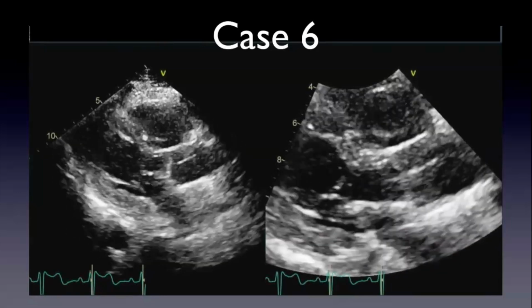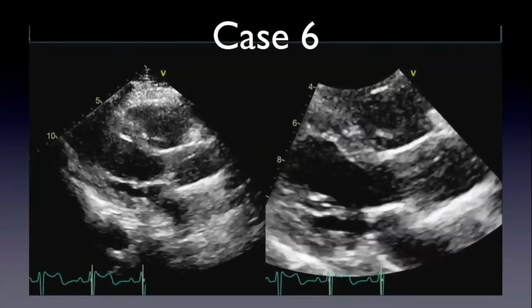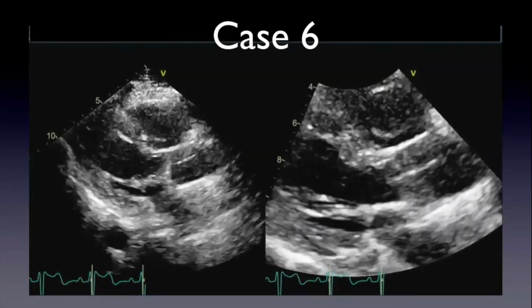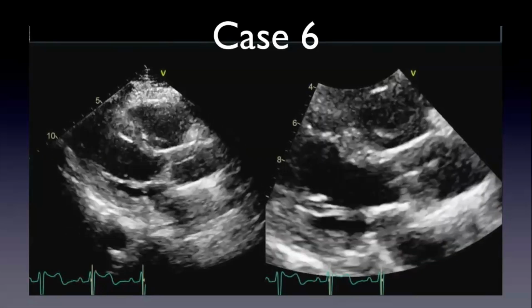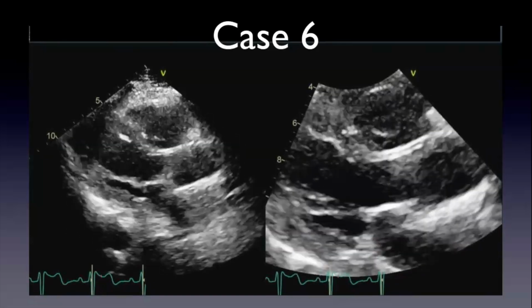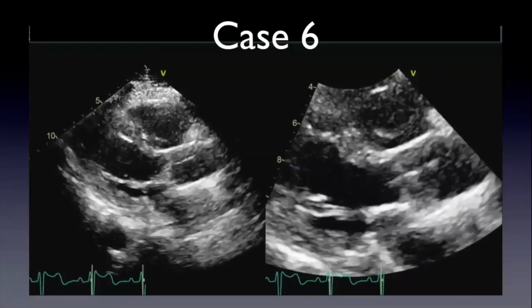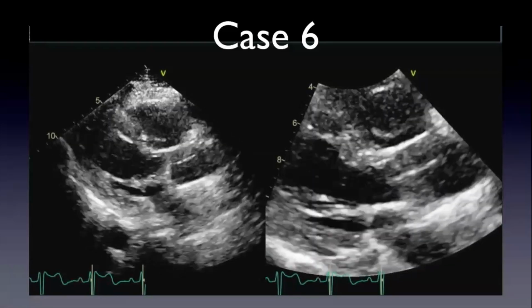Okay. And then looking at the zoomed in view on the right, specifically the aortic valve, you can kind of see the leaflets opening there. Yeah, and they open pretty well. You get a sense of the linear density of the graft. You kind of see the graft there. Immediately above it looks like the RV. Immediately underneath it looks like left atrium. I don't see any collection or anything untoward.